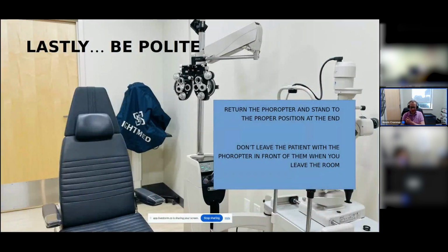Lastly, I will say, just be polite. I've seen patients get refracted and then get left in the exam room with that phoropter right in front of their face. Don't do that. Undo the knob on the arm that holds the phoropter in place. Bring the phoropter to that resting position. Tighten the knob with it in the high position there, so that it's out of the way. And be nice to the person next to you or who's using the room next after you. And that's really pretty much it.